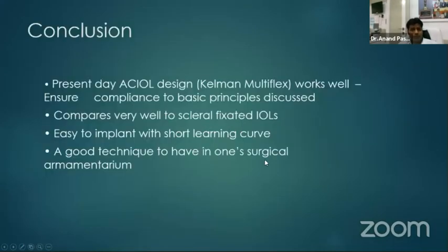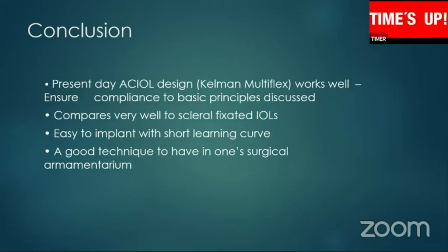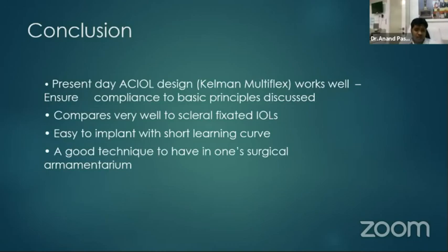In conclusion, the present-day anterior chamber IOL works well when implanted correctly, and it compares well to scleral fixated IOLs. Though scleral fixated IOLs may fare better in the long term, it can save the day on a bad day for a young surgeon who has not learned the technique of scleral fixation of the IOL. So it's a good technique to have in one's current surgical armamentarium.